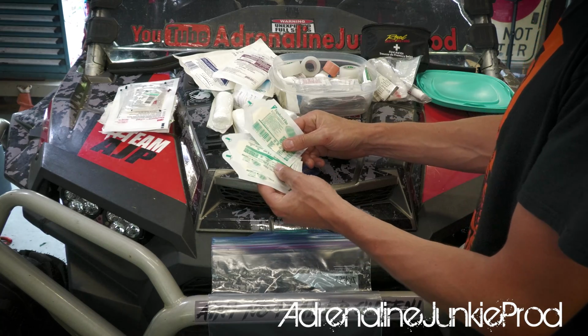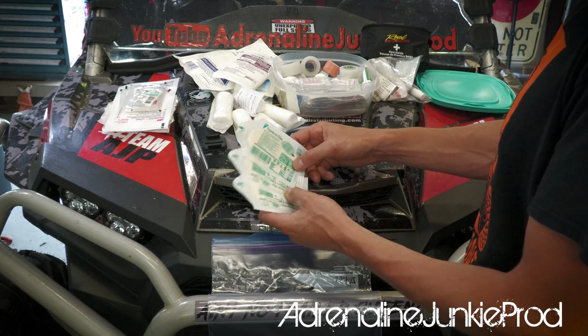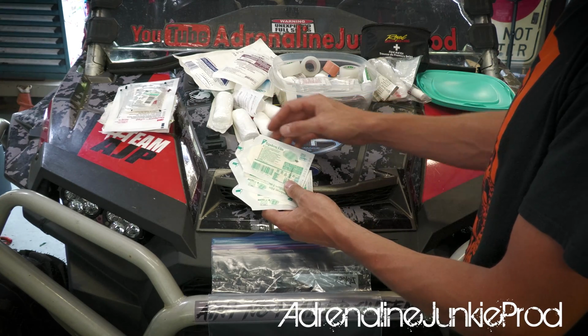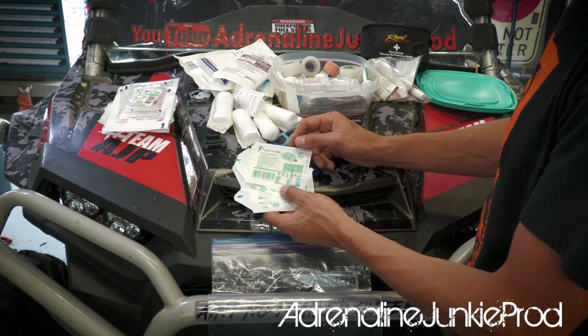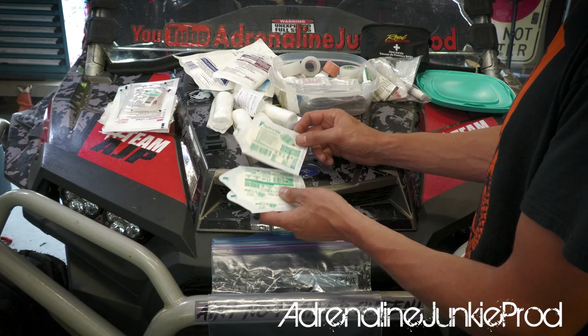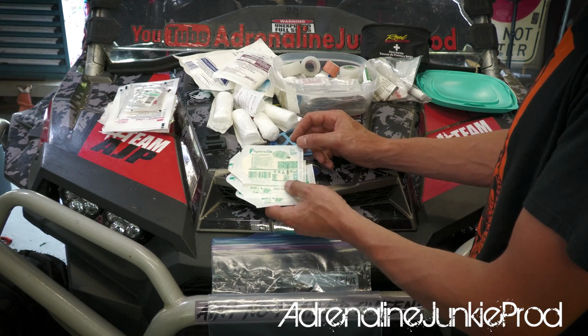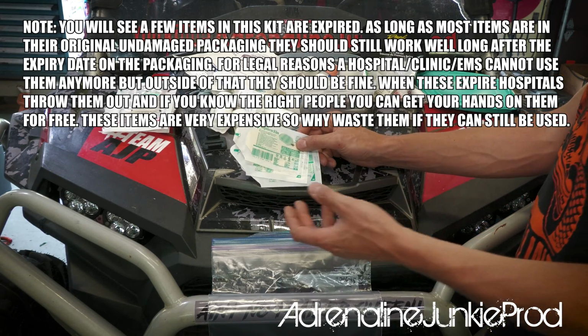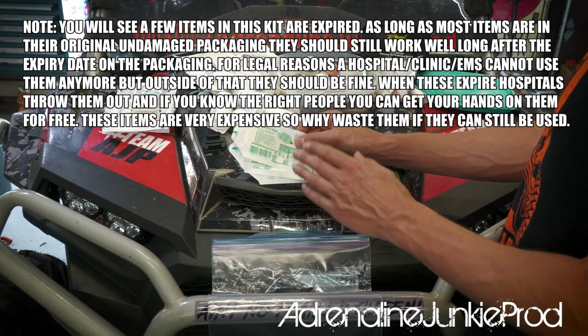Tegaderm film. Tegaderm is magical stuff. If you've ever had an IV, then you've seen Tegaderm. It's basically a clear plastic. It looks like saran wrap, but it's adhesive on one side, yet breathable. It's great at covering up a wound. You clean the wound, you dry the wound, you apply this. It's awesome. If you're getting a blister on your foot, or you've got a small burn, it's great to keep the elements off of it.